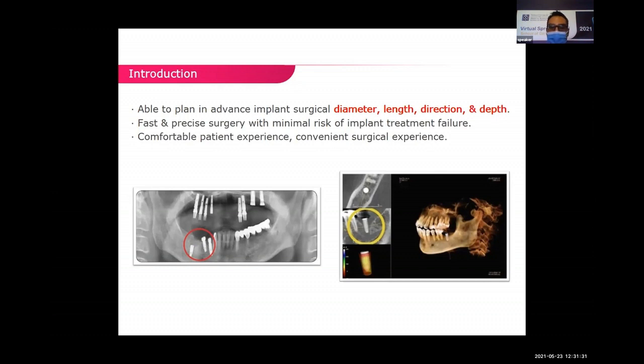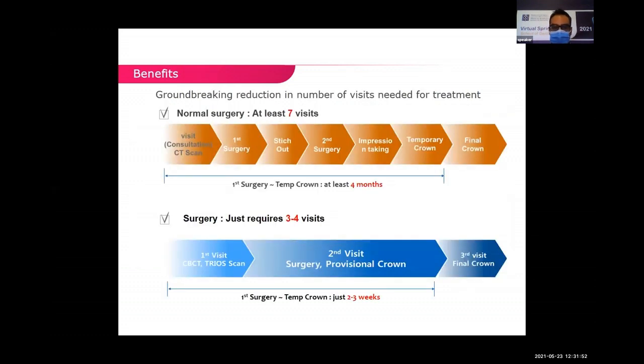What are the advantages of digital implantology? The advantages are that we can program and plan where to place the implant, and we can plan the depth of insertion, the direction of insertion, and also the angulation of the implant placement. Other advantages are additive values such as time saving for both the patient and the practitioner.